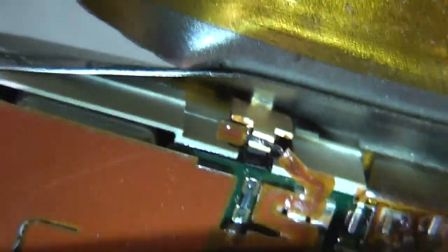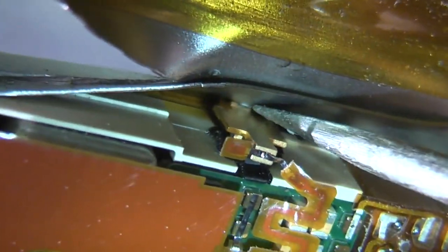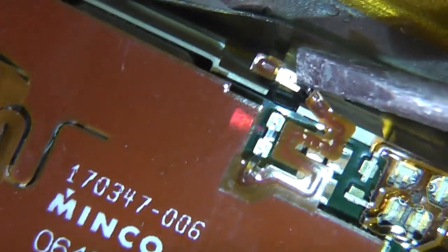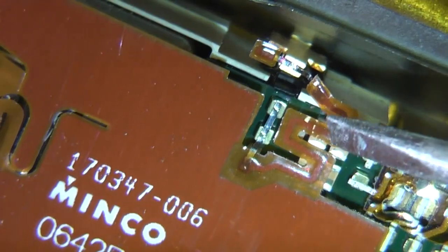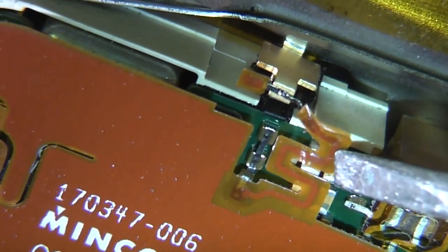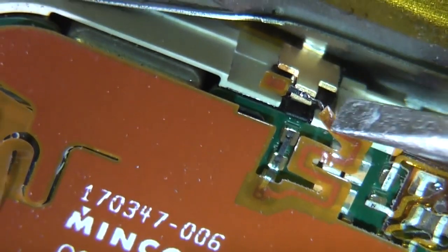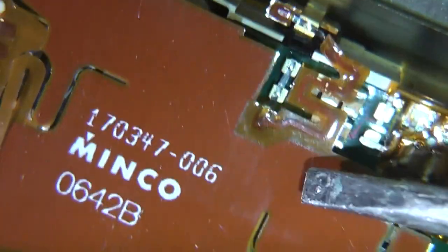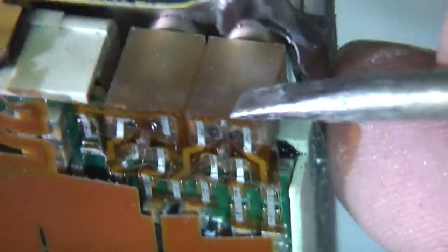Not quite sure what's going on here. There's this piece of metal at the bottom end that looks like it's welded to the case, and then there's this connection that's welded to that. Now I don't know whether that's just an earth connection or maybe some sort of antenna or something. And this zigzag could simply be for flexibility, so that this thing could come out and flex a little bit without fracturing, so not quite sure about that yet. These are the connections through to the outside.